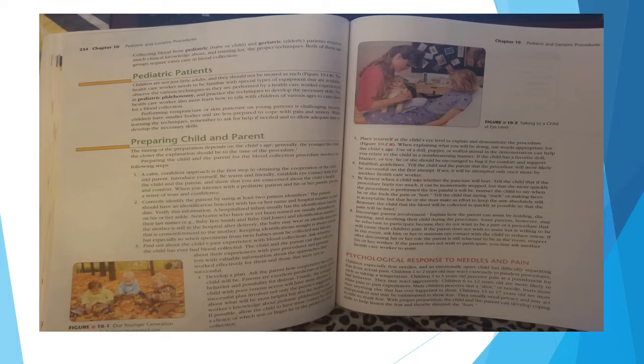When learning the techniques, remember to ask for help if needed and to allow adequate time to develop the necessary skills. Preparing child and parent. The timing of the preparation depends on the child's age. Generally, the younger the child, the closer the explanation should be to the time of the procedure. Preparing the child and the parent for the blood collection procedure involves the following steps.